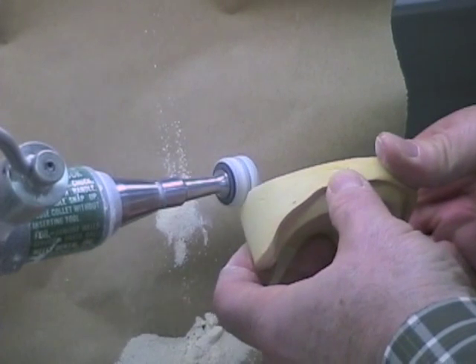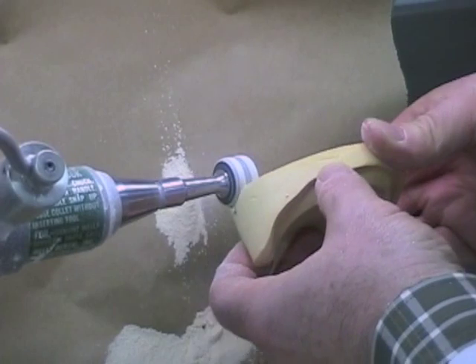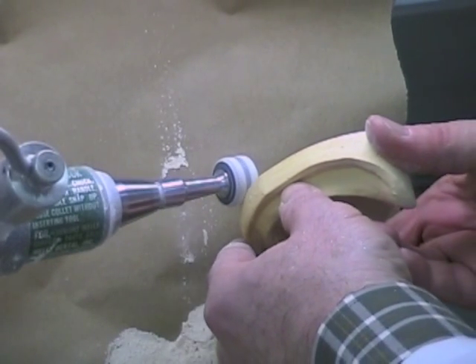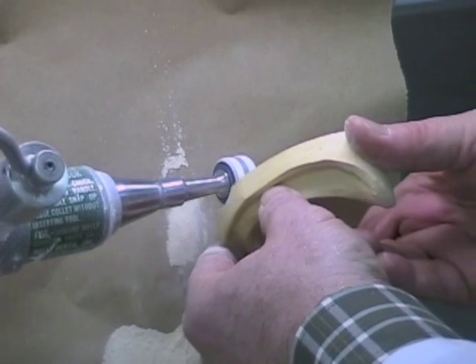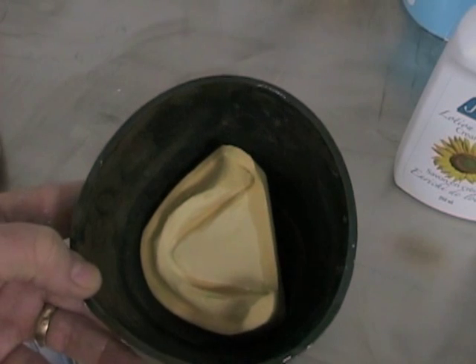Before mounting your mandibular cast, place some shallow, rounded grooves in three widely separated areas on your cast, similar to what you did in the maxillary arch. You see two at the back and one at the front. Dampen your cast before adding mounting plaster to it.